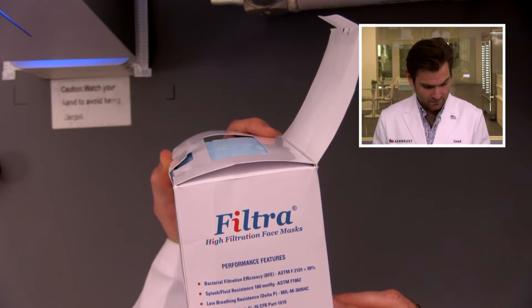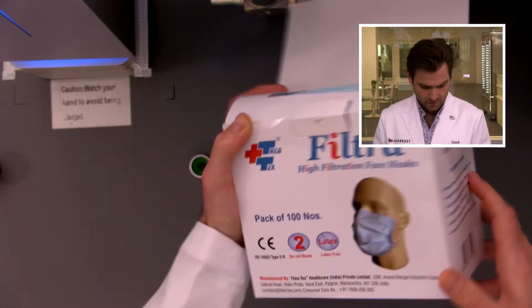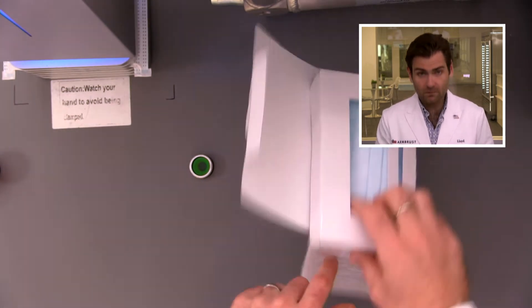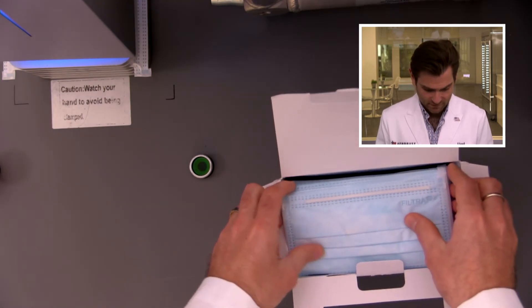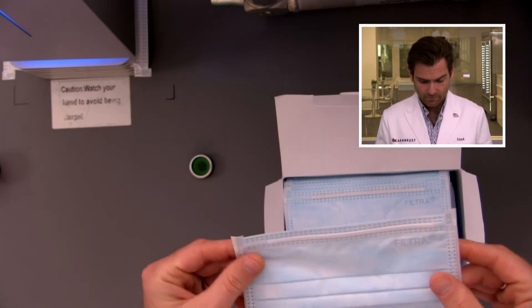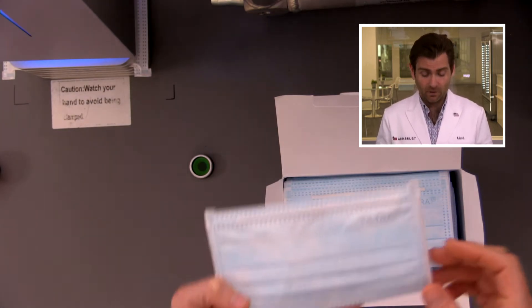This is made in India. They have 99% BFE on there, but BFE is useless because bacteria is so large. This seems to be a really big company — they've got lot codes and everything on there. When you open it up, I don't love that it's not sealed at all. Depending on what this has been shipped in, coming from India, it's a long trip to get here. I do love that they're putting their logo on there — that's a good sign. If you see someone's logo on there, that means they're probably going to be standing by the product a little bit more.